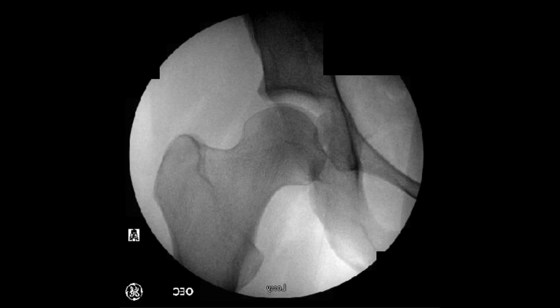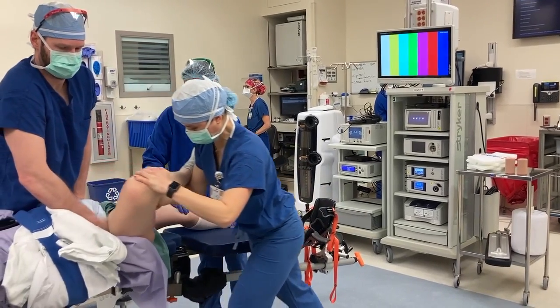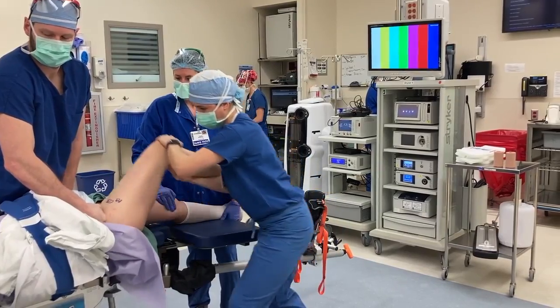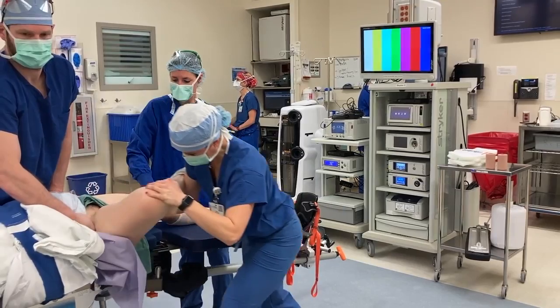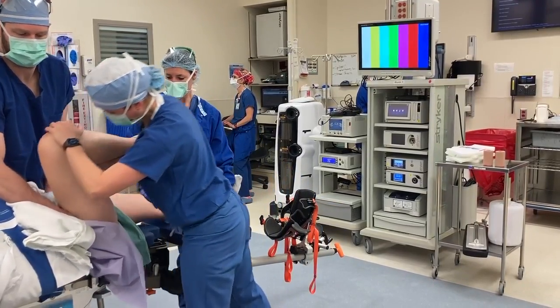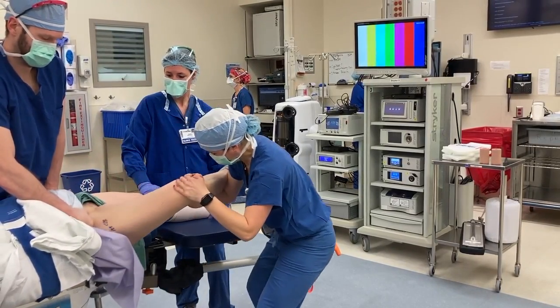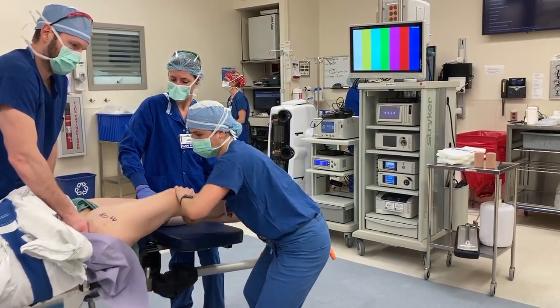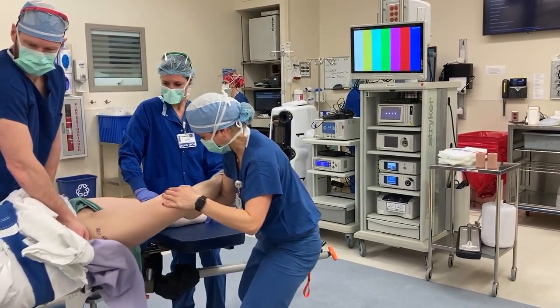Fluoroscopy can be used to confirm joint distraction, which typically is less than the one centimeter of joint distraction used for hip arthroscopy procedures. The manipulation then begins. An assistant stabilizes the pelvis while the surgeon performs hip flexion, abduction, and external rotation circumduction into hip extension. More focus is placed on the external rotation extension circumduction as opposed to internal rotation, as this tends to be the area where the patient feels the most motion restriction. This is performed with gentle but not excessive force in a controlled manner. Ten to fifteen total manipulations can occur, with frequent pauses and static motion checks to help determine whether the manipulation is complete.